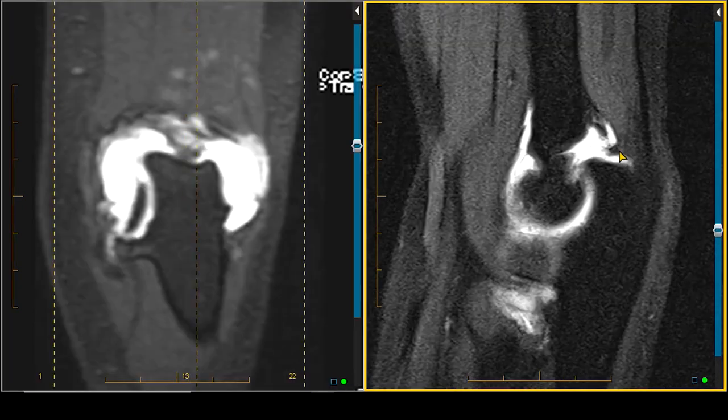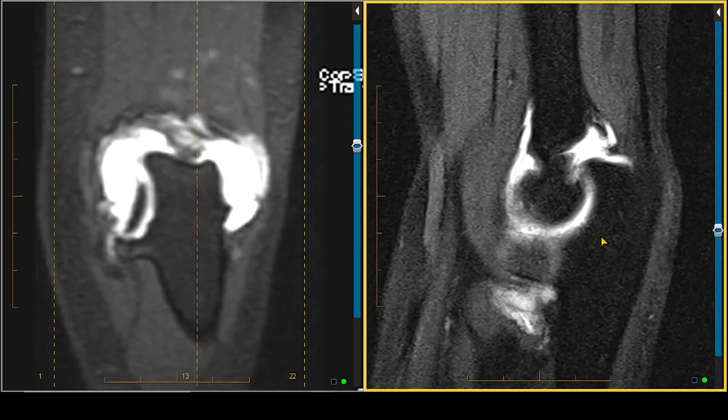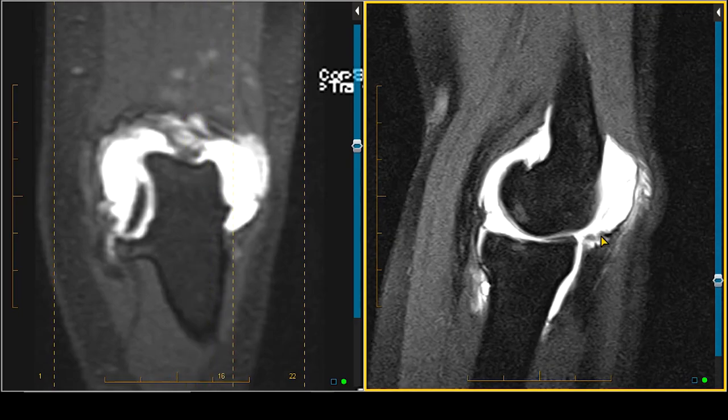On the lateral sagittal view you can see there's even a little bit of cartilage fissuring happening. All part of this entire process, and it all stemmed from the fact that this person years ago had a supracondylar fracture.